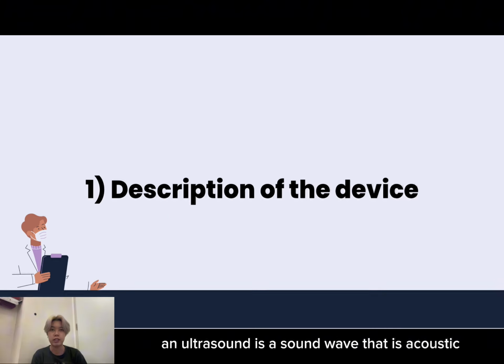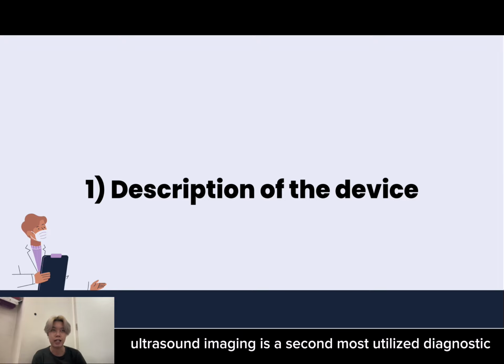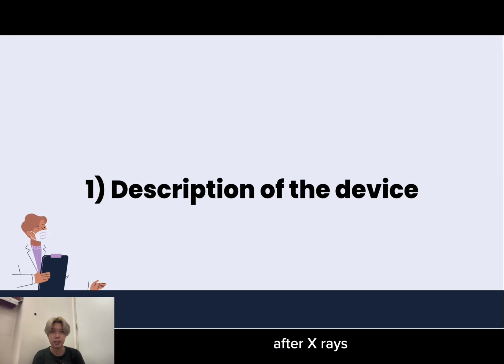An ultrasound is an acoustic sound wave that propagates through a medium by means of vibrations of the molecules that make up the medium. Because of this, ultrasound imaging is the second most utilized diagnostic imaging modality after X-rays.